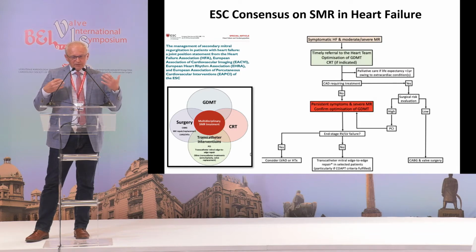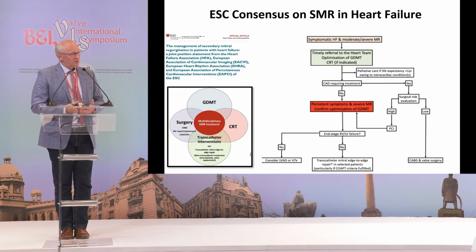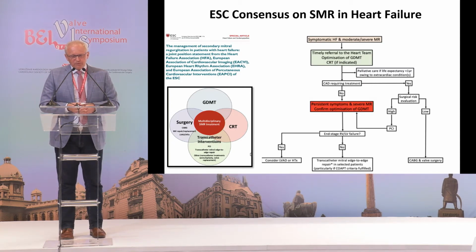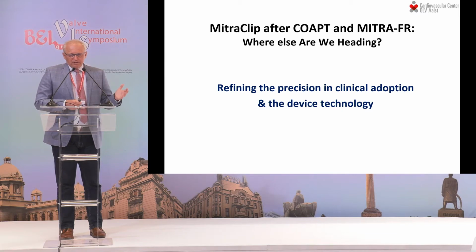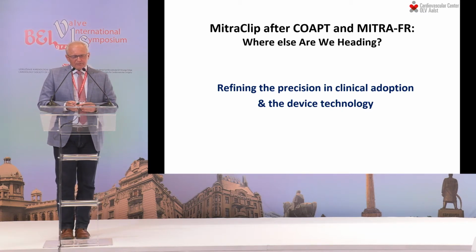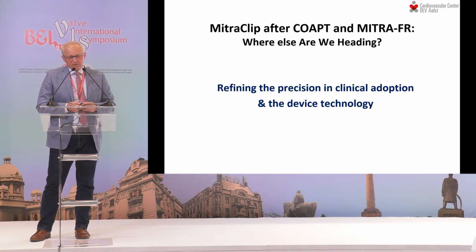Paying attention to the life expectancy, to the presence of ischemic heart disease, to the dyssynchrony, to the staging of the heart failure, and then taking the thoughtful multidisciplinary decision about whether or not the given patient should be or could be a candidate for the leaflet therapy. That's one direction that we are heading. The second direction is refining the precision of how we are going to adopt the therapy, and improving the device technology.